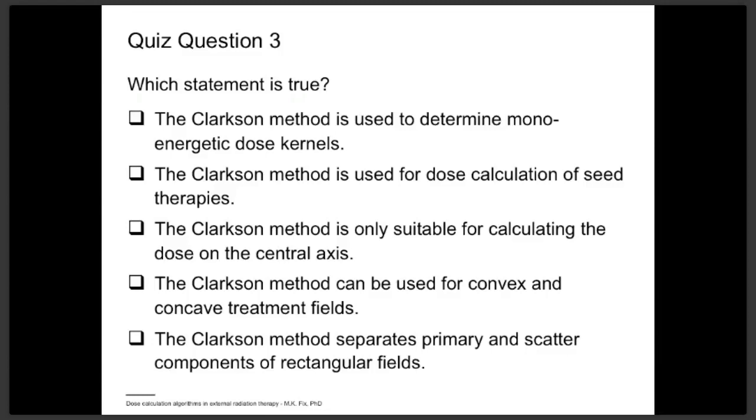Okay. And then we have one more question, which is not public, but private. Is TAR good up to 3 MeV? Which would be monoenergetic. This is borderline. In a 6 MeV beam, the spectral contribution of 3 MeV is rather small, so that would still be fine.